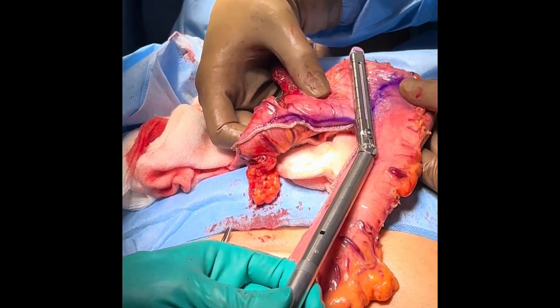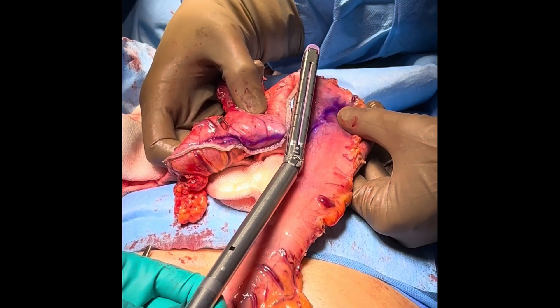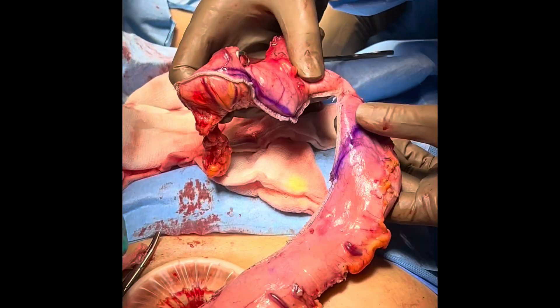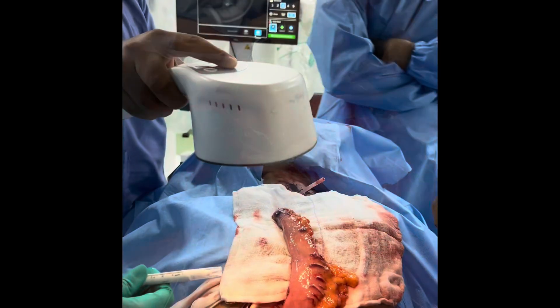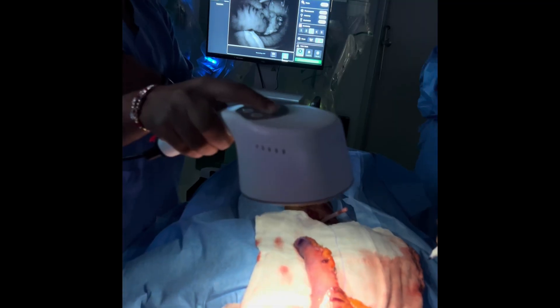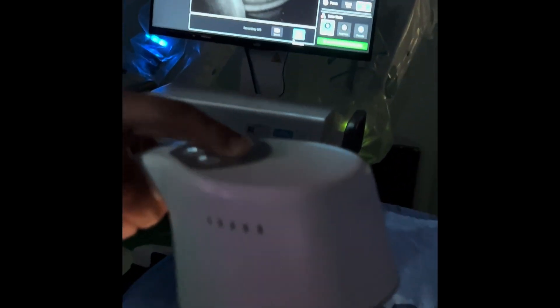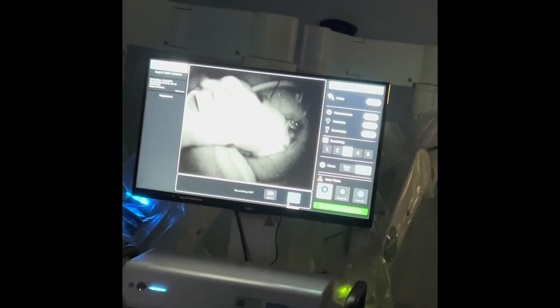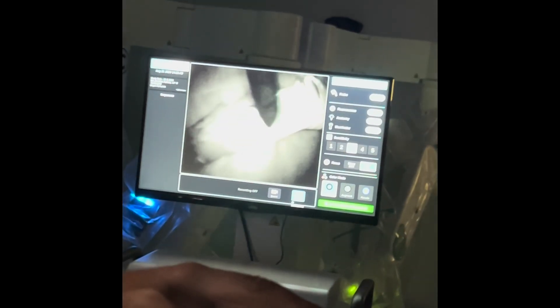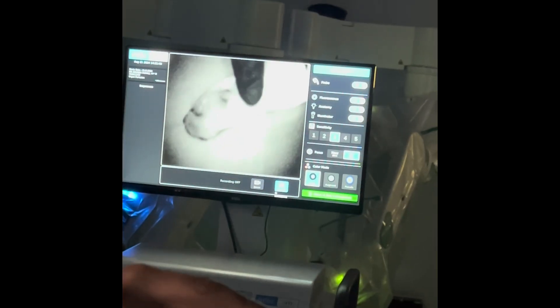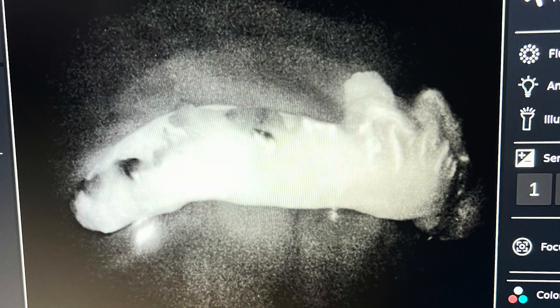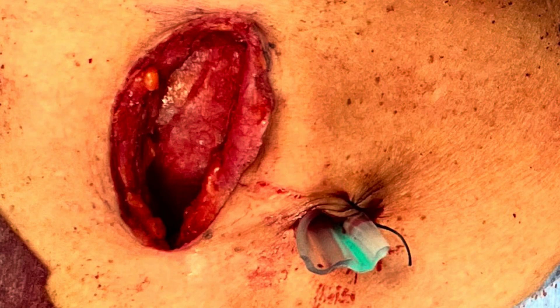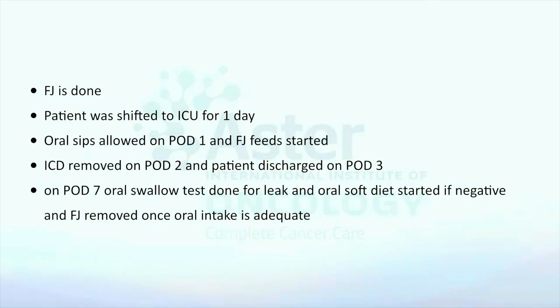Once the stomach tube is completely formed, we give IV ICG of 3 ml, then check the vascularity of the stomach tube. You can see the entire stomach tube being lit from base to tip, confirming adequate vascularity. After this, we do the anastomosis with a powered stapler. We close the neck over a drain and a feeding jejunostomy (FJ) is done.